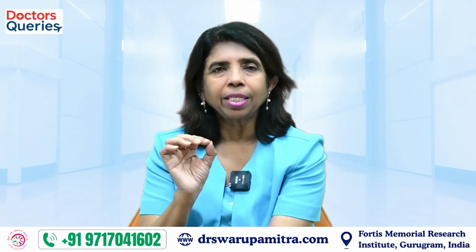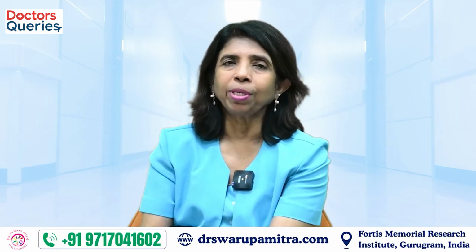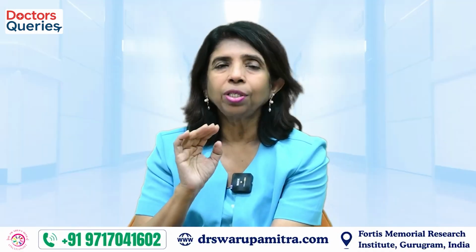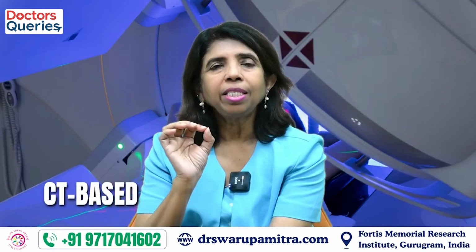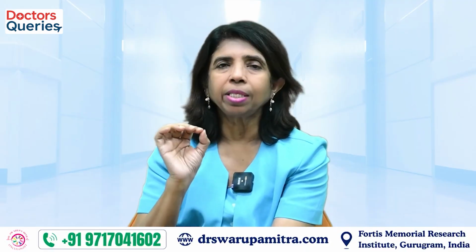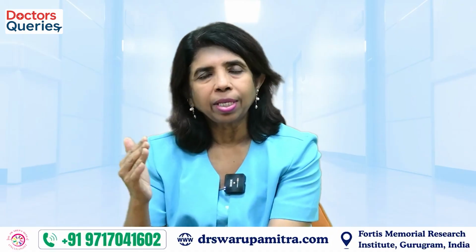Now, these X-rays are used to treat cancer with the help of a machine called a linear accelerator. So, most of the radiation machines which we have in India and abroad are CT-based linear accelerators. We have MRI-based linear accelerators too, but about this we are going to talk sometime later.